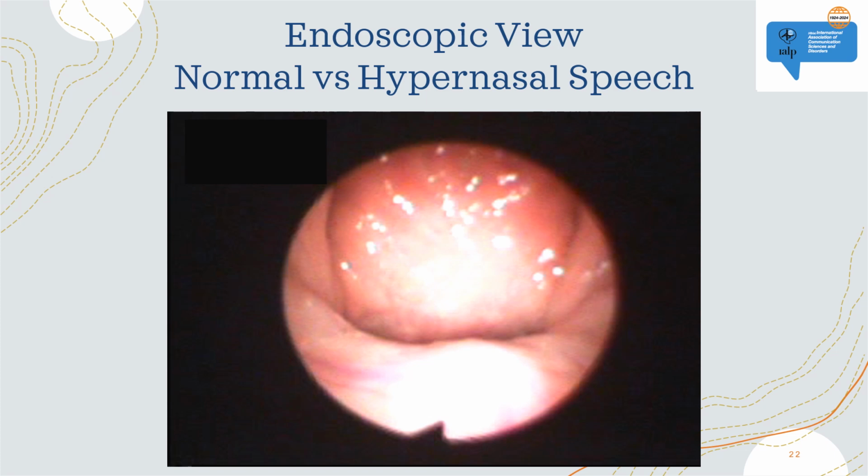I'll show you a video of me demonstrating normal and hypernasal speech during endoscopic examination. You will see that in normal speech, the VP port is closed, and in hypernasal speech, the port is wide open.